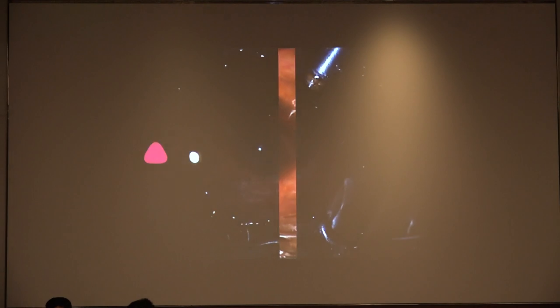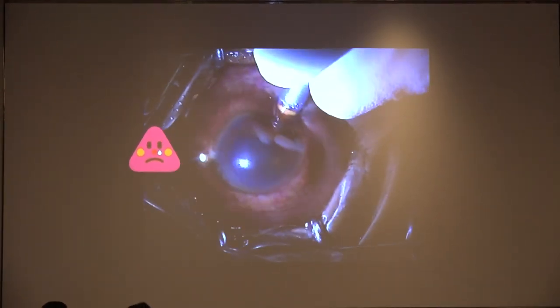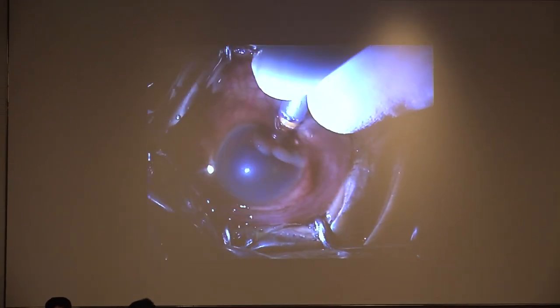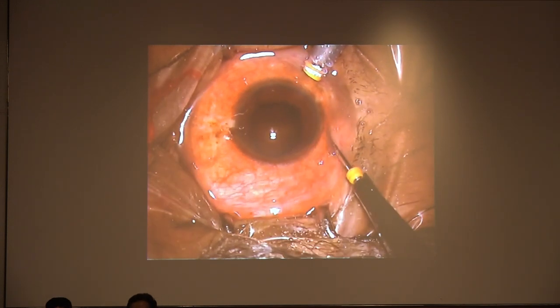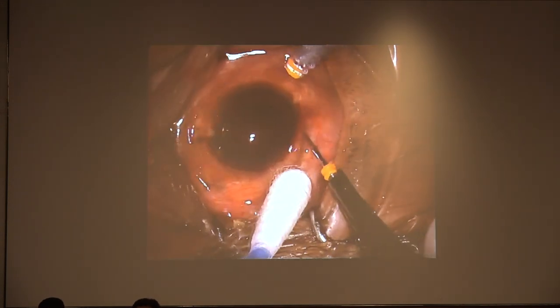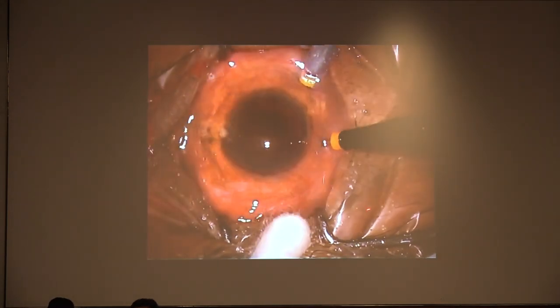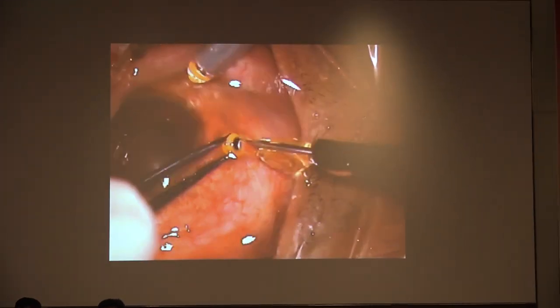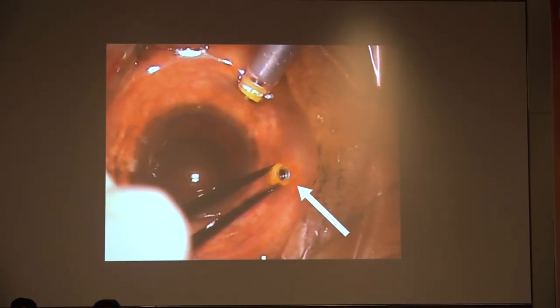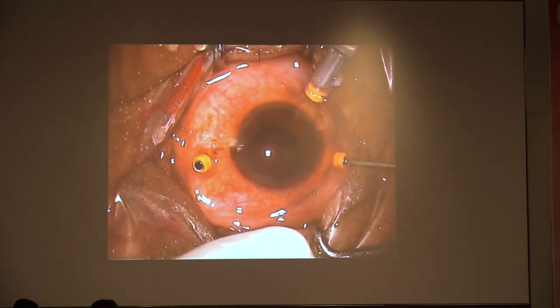I thought that was probably some choroidal detachment, and I put in the infusion, and I was in a mess. I couldn't really see whether the infusion cannula was inside the vitreous cavity or subretinal. So I didn't open up the infusion, and we went in with the next port. Same story, very soft, with a lot of twisting and turning, and again there was egress of fluid. I thought, okay, if there is a choroidal detachment, then it's taken care of. Again, I tried to see whether we were inside or not and couldn't find out.